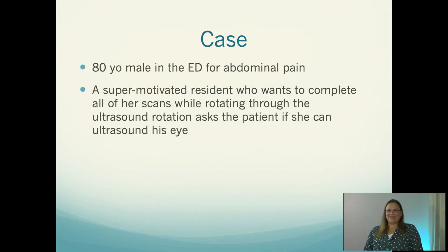Moving on to our next case. We have an 80-year-old male in the ED for abdominal pain, a super motivated resident who wants to complete all of her exams while rotating through the ultrasound rotation. Asked this patient if she can ultrasound his eye. And he says, sure, I'm waiting around a few hours for my CAT scan, why not?